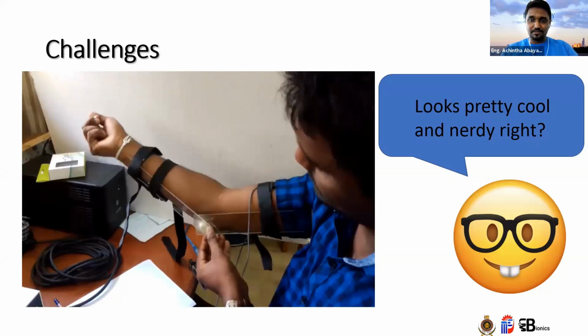So you could say it was a waste of time, but the things we learned during that time were very fruitful for our success in our research, because it's basically tempting to think that there could be a relationship between the EMG signal and the arm, or the EMG signal and the joint angle.